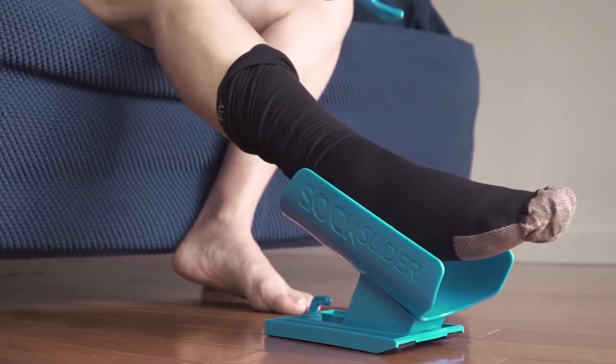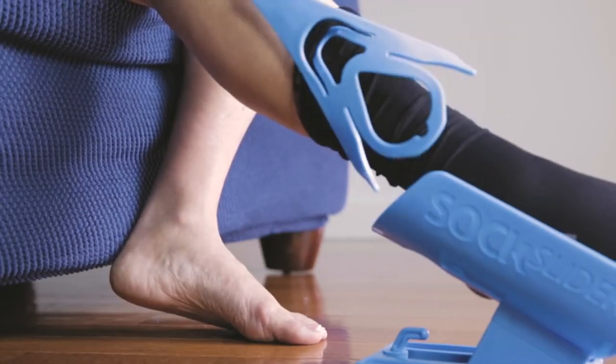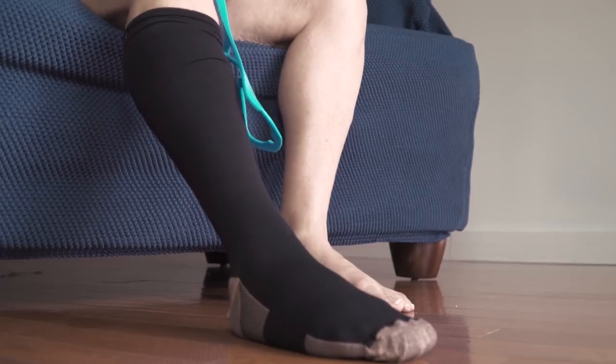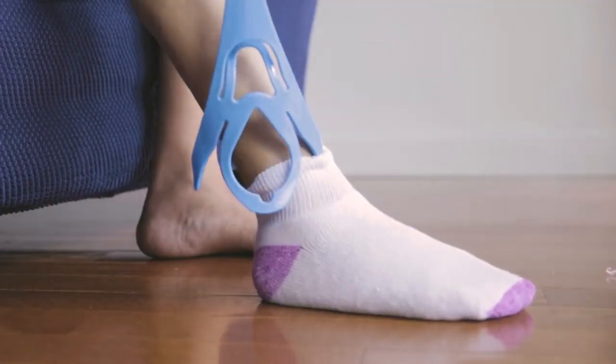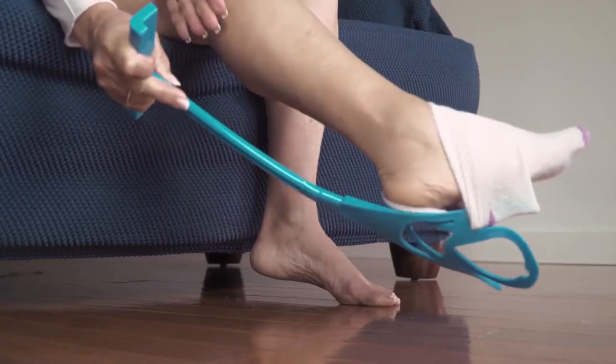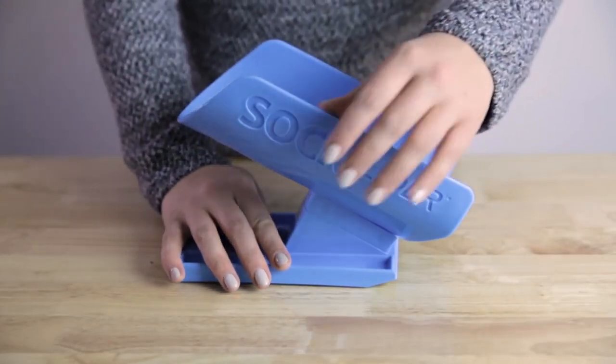Use the lifting tab for compression and tube socks, located on the handle, to help pull up the cuff of your tube, compression, or other long sock. To remove your sock, from a comfortable seated position hold the handle, insert one of the sock removal tabs, and push downward until your sock comes off.